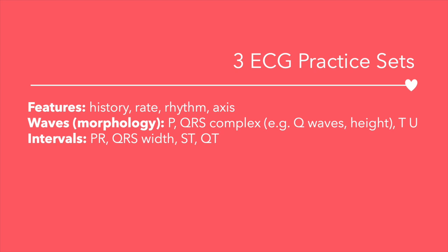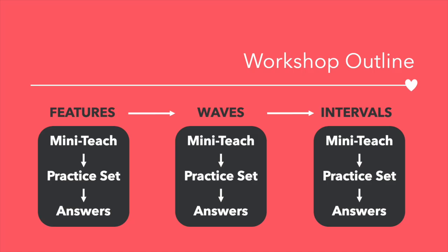The third set are ECGs that ask you about the intervals, which include the PR interval, QRS width, ST segment, and the QT interval. Prior to each practice set, I'll be doing a mini teaching session to prepare you for success in that practice set. After each practice set, we'll have a chance to review the answers together.